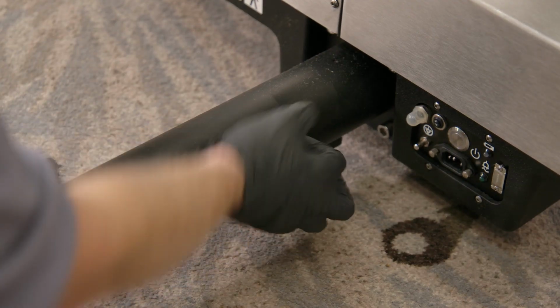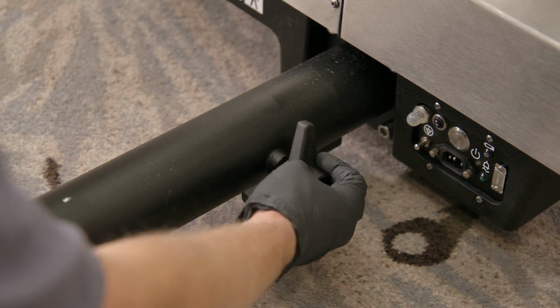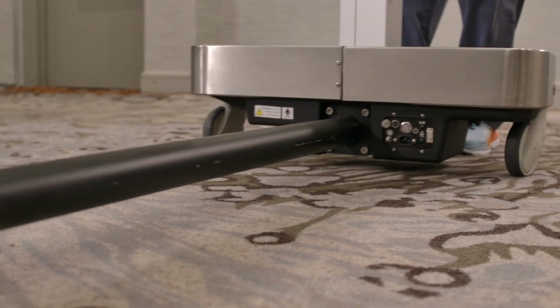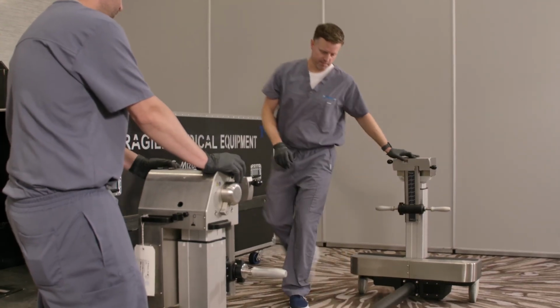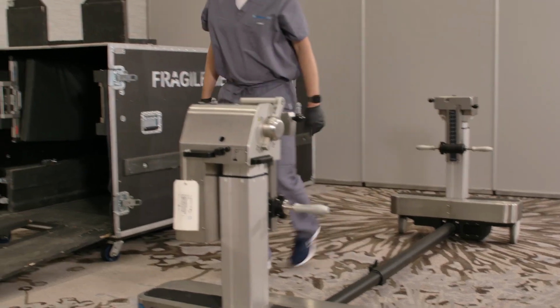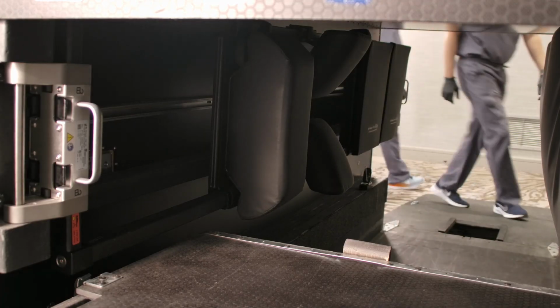Turn the knob at the bottom of the table to loosen the bolt for the table extension. Then pull the table to extend it so that the tabletop will fit. When the table is extended, tighten the knob. Head back over to the crate and pull out the translucent tabletop.